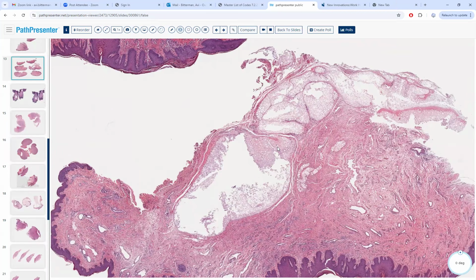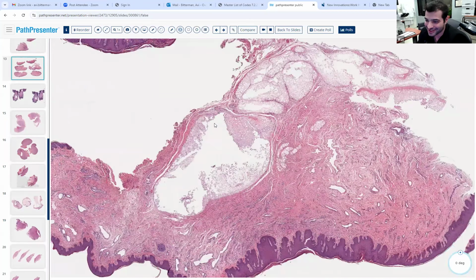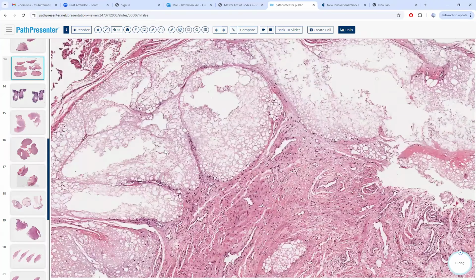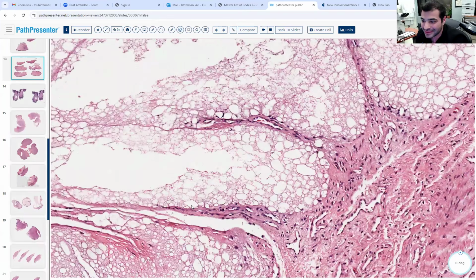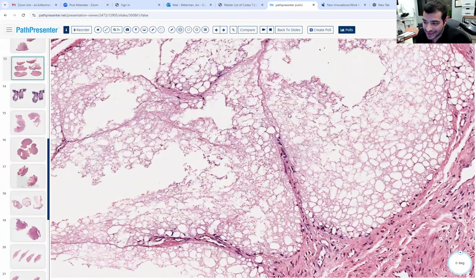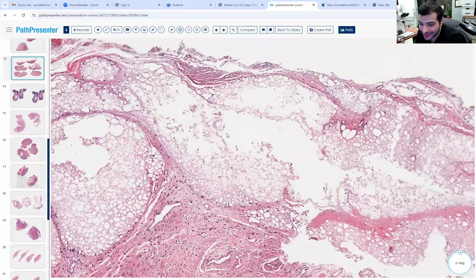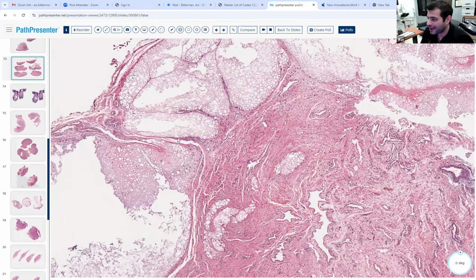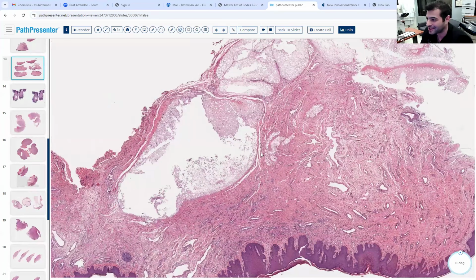Oh, it's Kenalog, triamcinolone. I thought it would be more blue or something. It's not really that blue. It's a little bit. It's more frothy. It's not hyaluronic acid. And yes, the reason there's no inflammation in response to this filler is that triamcinolone is making it that way. It's by design.